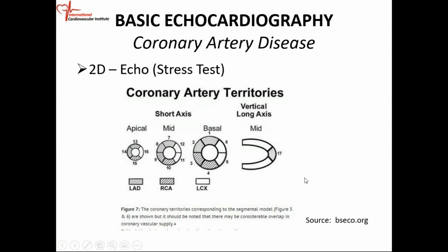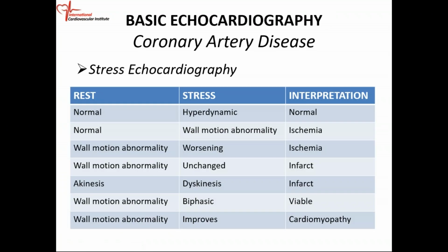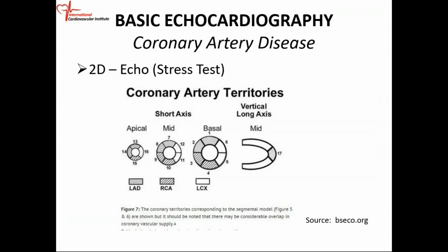And then, the apical cap, this is the 17th segment, the apical cap, is LAD. So these are your coronary artery territories. And then for the apical views, you need to remember those segments. So let me quickly draw the apical segments so that we don't miss anything.